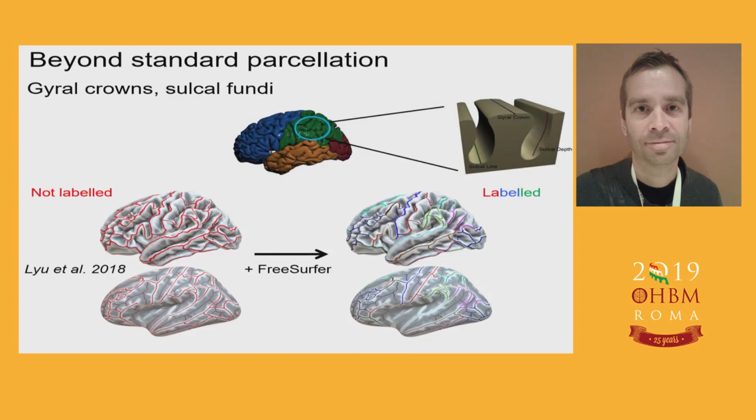There's also the matter of parcellation. We all know the standard FreeSurfer parcellations, for example, the Desikan-Killiany atlas, which is a default outcome if you run the FreeSurfer pipeline. But it might be that for your research question, these standard parcellations are not sufficient. So there are now software packages available and being developed as we speak that will allow a more custom parcellation that might be more appropriate for your research design.